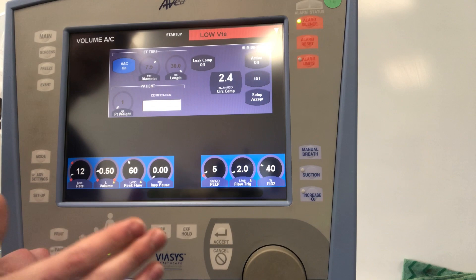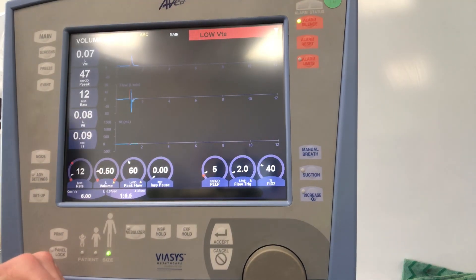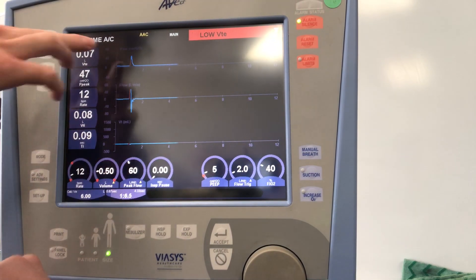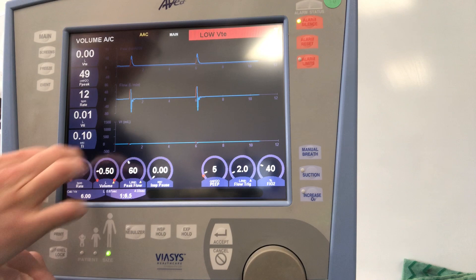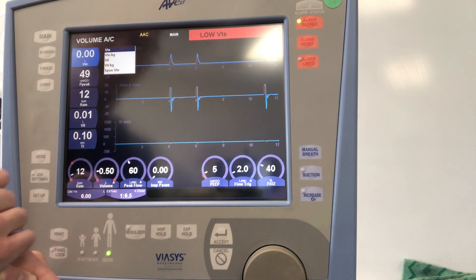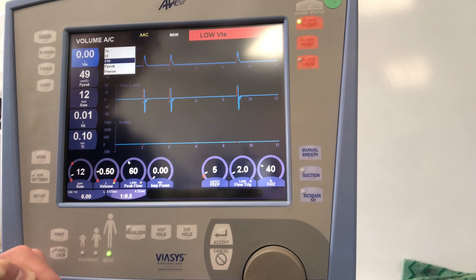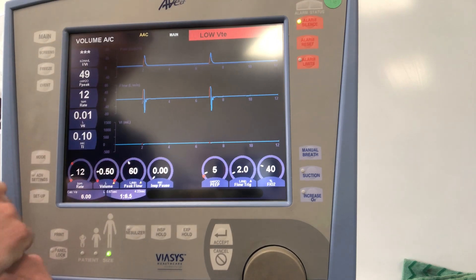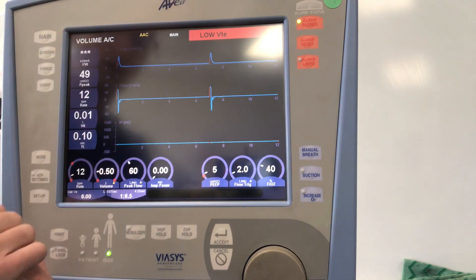Once you're happy with everything — you've done the EST, initial settings — go ahead and hit setup accept. That'll take you into the actual ventilation mode. The default display on the Avea shows pressure, flow, and volume. We can modify the values shown on the left; for example, we can display leak, total minute ventilation, and the big one: frequency over tidal volume, or RSBI. You basically have five things you can display while watching your waveforms.